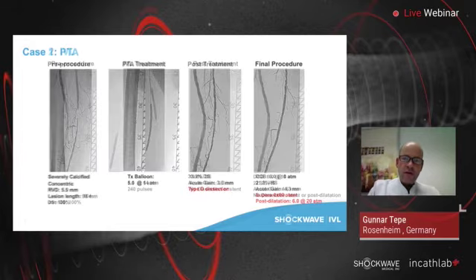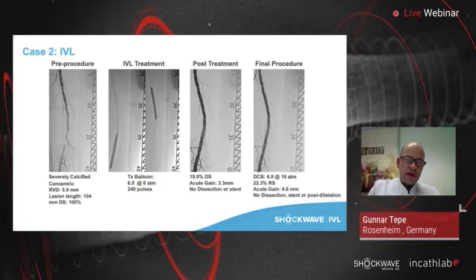Case number 2 was a lesion which was similar, I would say a little bit longer, but also calcified here.